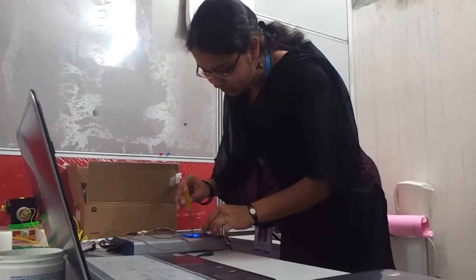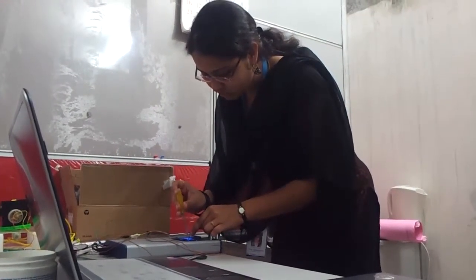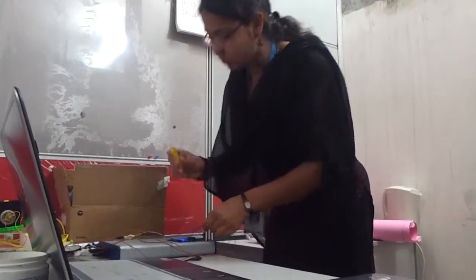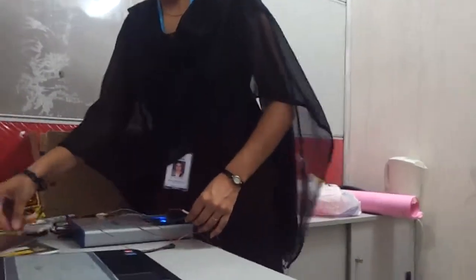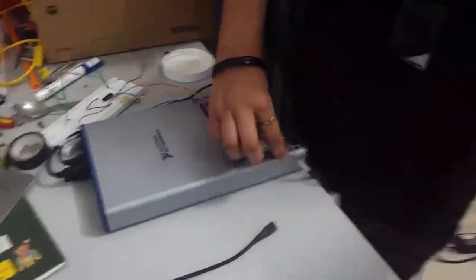Hello, welcome to the demo for an electrooculogram based testing system for detecting nystagmus and strabismus, which are two eye disorders. Here I am connecting the electrodes, which are silver electrodes, to an NI Elvis board. The purpose of these electrodes is to get the electrooculogram.